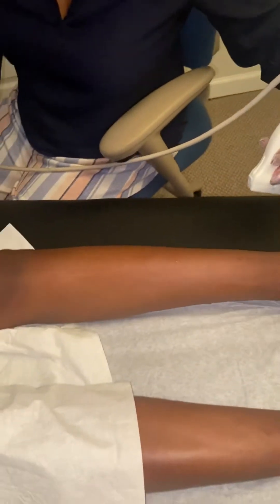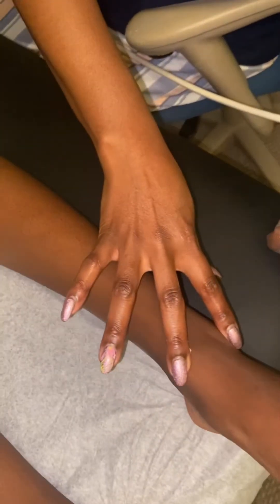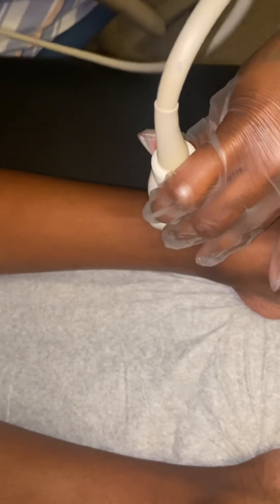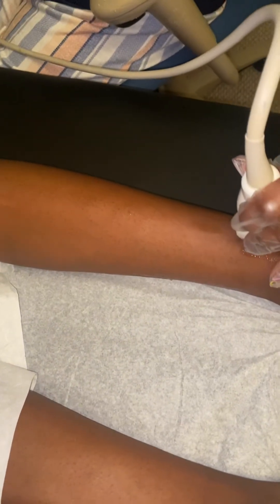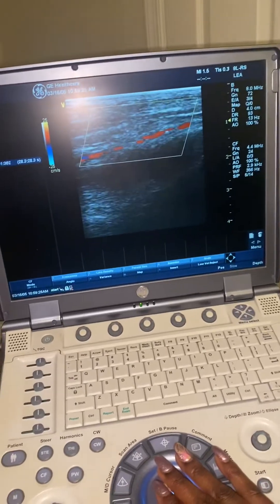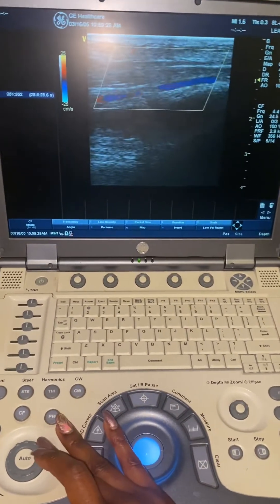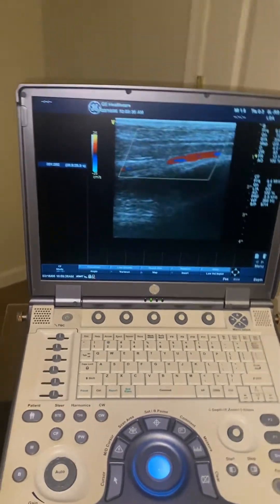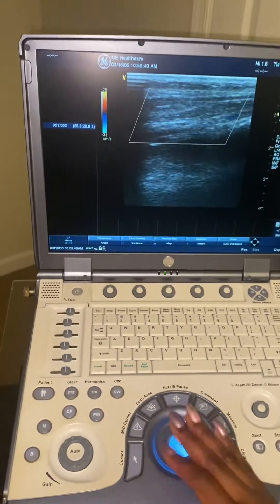When you're looking at your calf vessels, another trick to obtaining the anterior tibial is looking at the foot. You want to put your probe right in here at the anterior aspect of the ankle — when you put your probe right there, you should be able to see your anterior tibial artery. This trick usually works for me all the time. Usually what I do is take a waveform, see if it's nice and triphasic, then I'm good. If not, I have to keep following it again. All you want to do is put gel right up here and just follow it up — at some point you might have to angle a little bit lateral, but just following up will help you identify your anterior tibial artery.